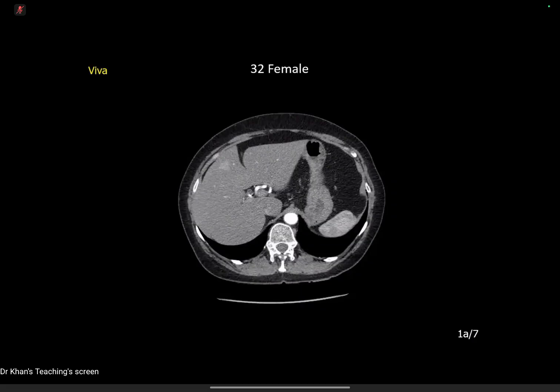In a 32-year-old female with a solitary hyper-attenuating lesion in the lobe, I'd be thinking about things like a hemangioma. Adenoma would be fat density, so unlikely. The other thing could be an FNH, because it's not as hyper-attenuated, it's almost iso to hyper, so I'd put that in my differential as well. METs would be less likely, given that it's single and the way it appears and in this age. So I'd obviously like to assess it with an ultrasound or an MRI.